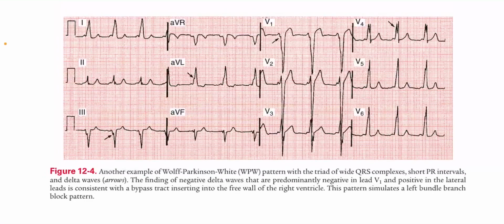This pattern simulates a left bundle branch block pattern.